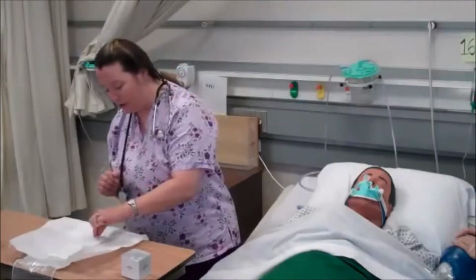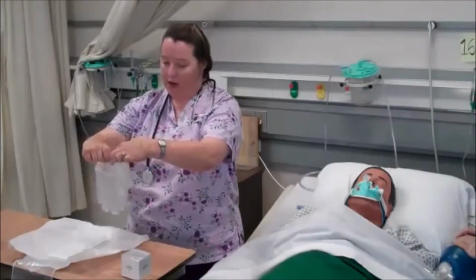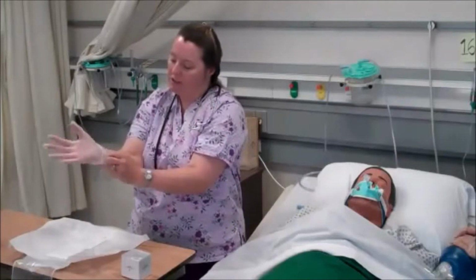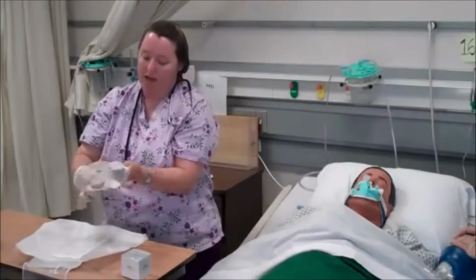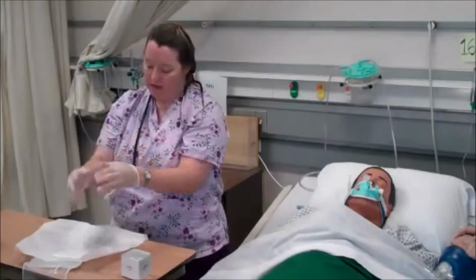I'm going to reach down and only touch that cuff part that's going to be touching my skin. And on here I can go ahead and glove my dominant hand first, again touching only the part that's going to be touching my skin. Now with my dominant hand I'm going to touch underneath the cuff here, and apply it to my non-dominant hand. Now sterile, I'll do a fit test.